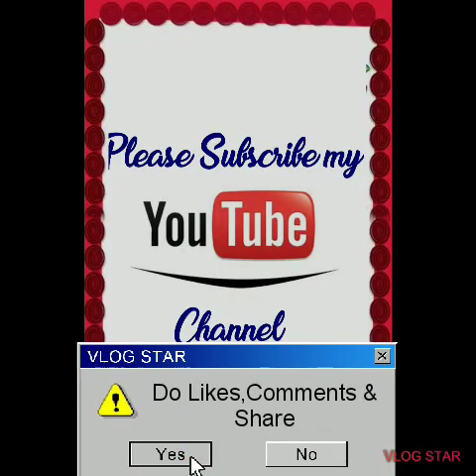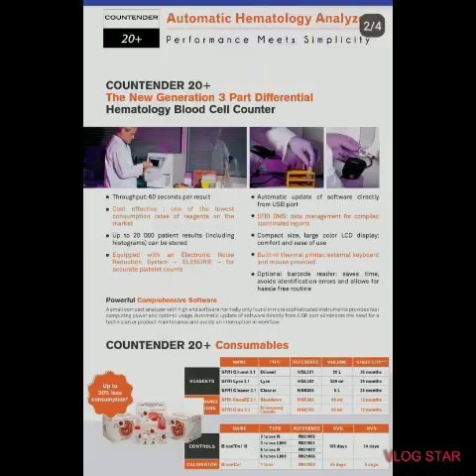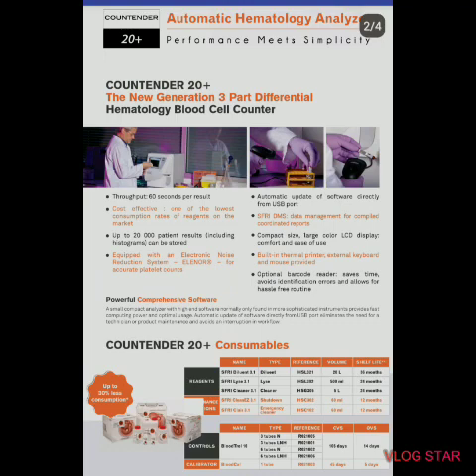Countender 20 Plus — the new generation 3-part differential hematology blood cell counter.